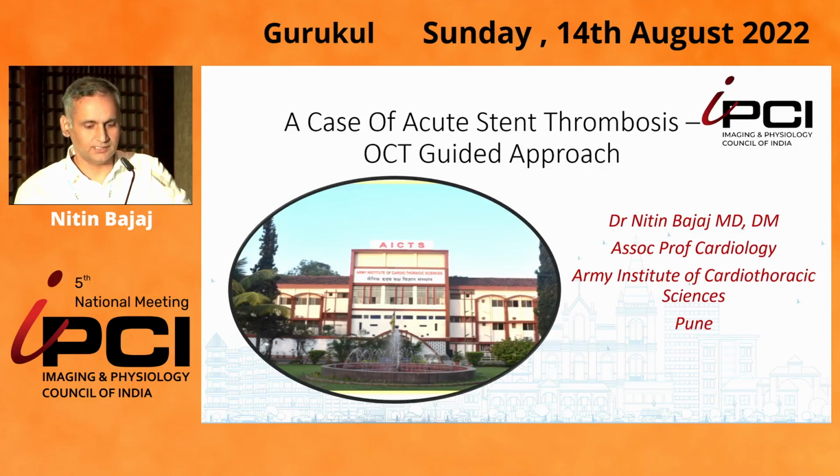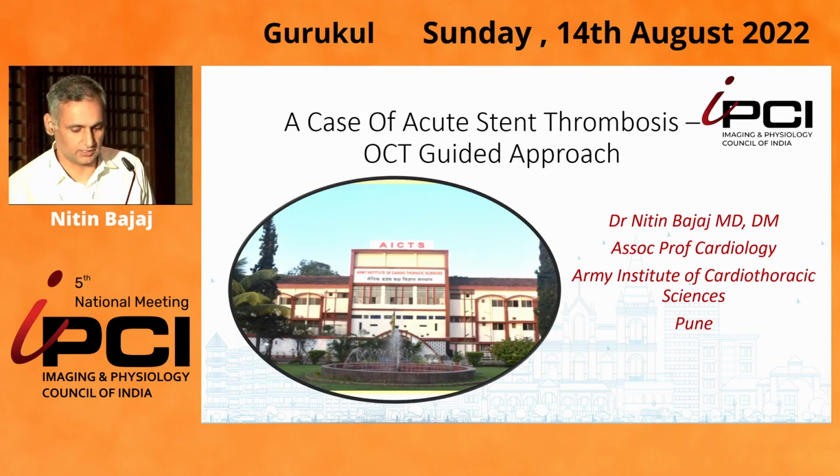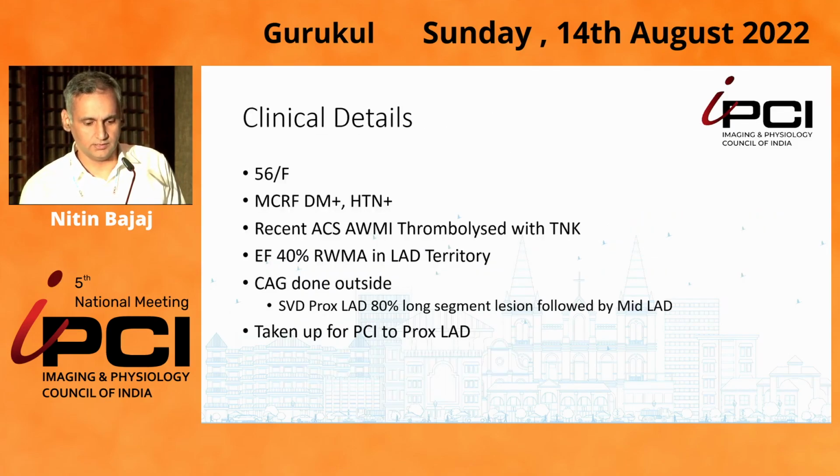Case of simple things that go wrong in our day-to-day practice. So I'm Dr. Nitin from Army Institute of Cardiothoracic Sciences. Just present a case of acute stent thrombosis and how we managed it.